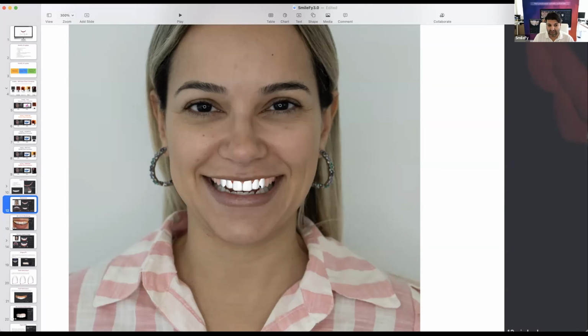In 2006, Jan Haito created a book with stone models of patients with beautiful, natural teeth, and the technician used these stone models as an inspiration to wax up the designs. Now all the teeth are in digital form.